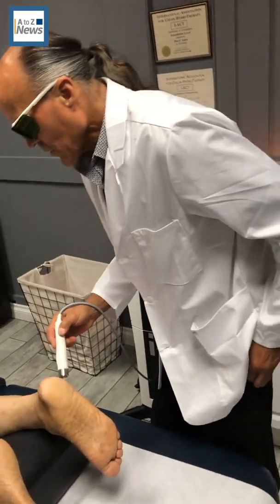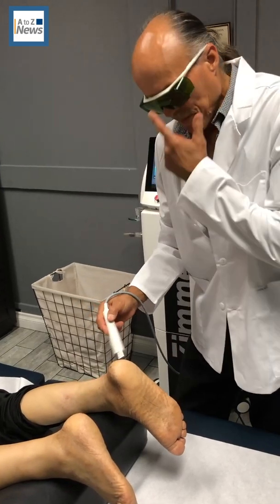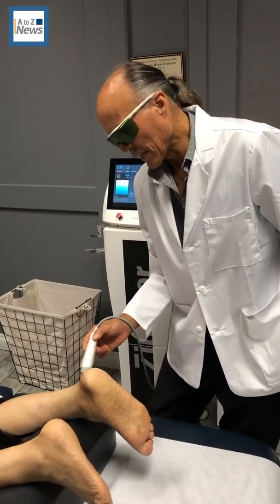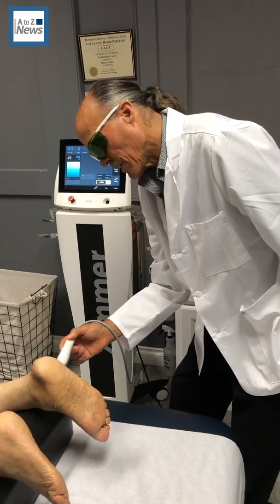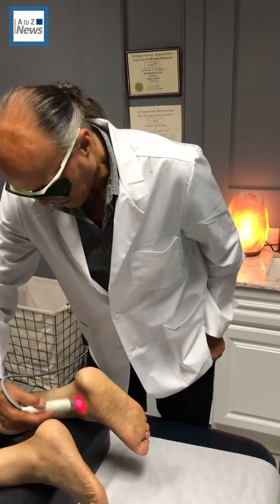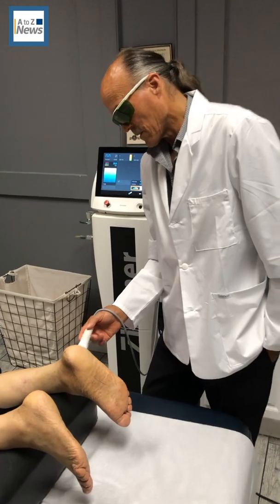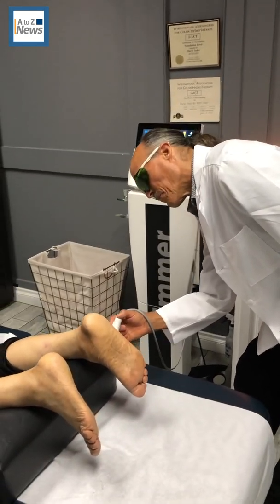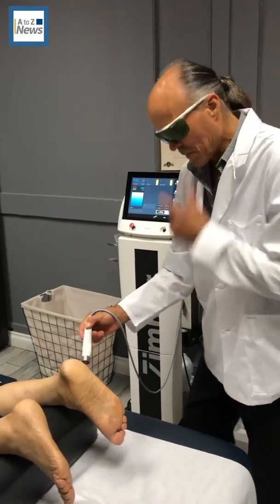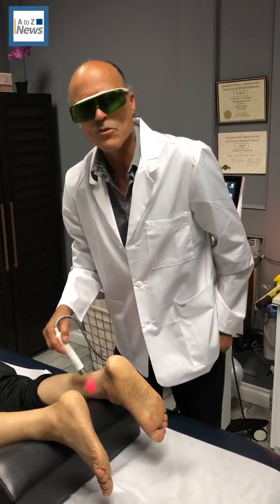I keep the laser moving around the injured area. The amount of joules — which is the light being put into the body — helps stimulate the mitochondria in the cells to produce more ATP, giving the cells more energy to bring them back to a normal state quicker. Most of the time, patients feel some type of relief right away on the first treatment, and every treatment after that they get up and say they feel better.